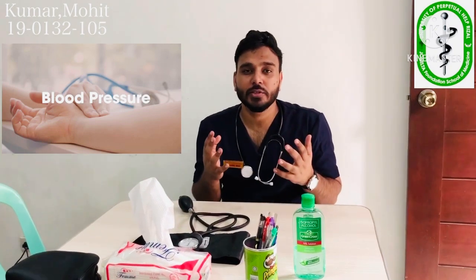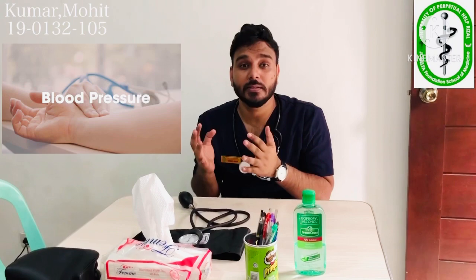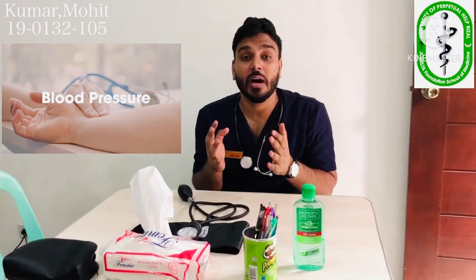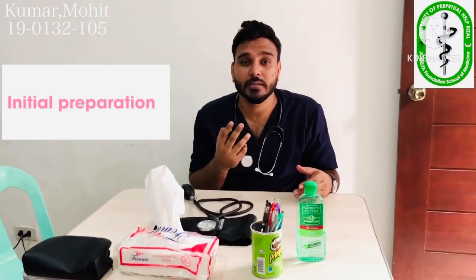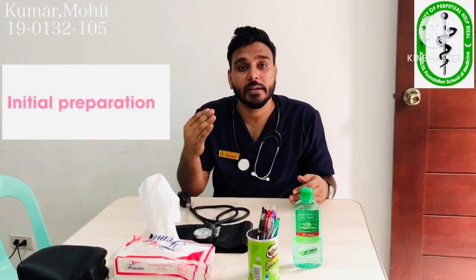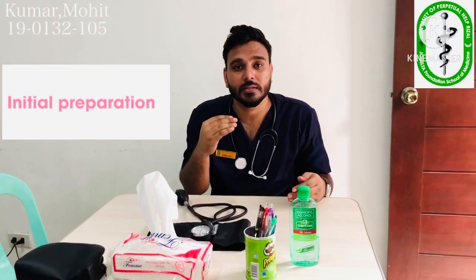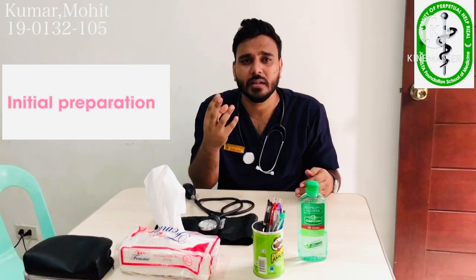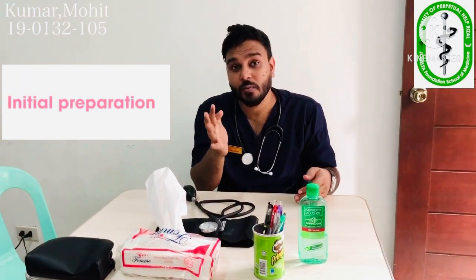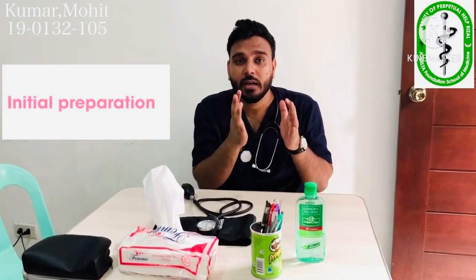Many diseases are related to blood pressure, so we have to know how to exactly measure it. While taking blood pressure, we have to indicate two points: one is the systolic pressure and the second one is the diastolic pressure — the pressure generated by our blood.